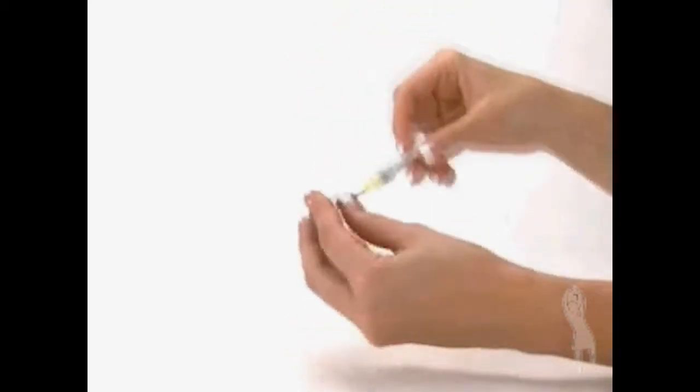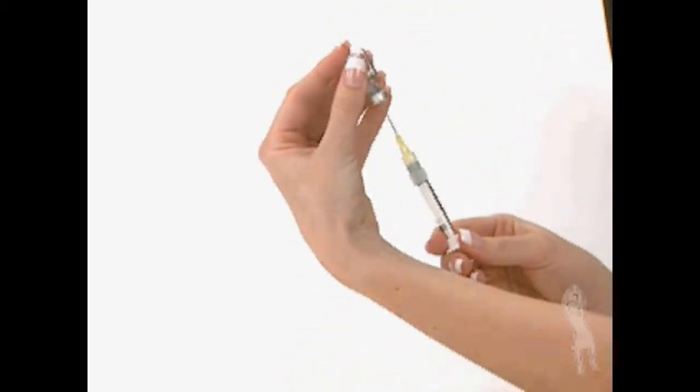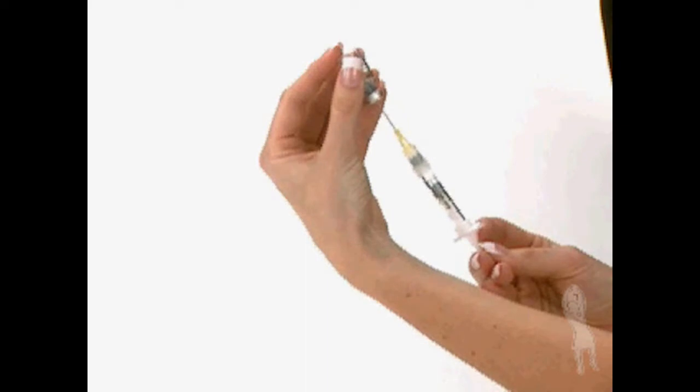Keep the needle in the vial as you lift the vial and turn it upside down with the needle pointing upward. Slowly pull back the plunger until the syringe fills with the total contents of the vial.